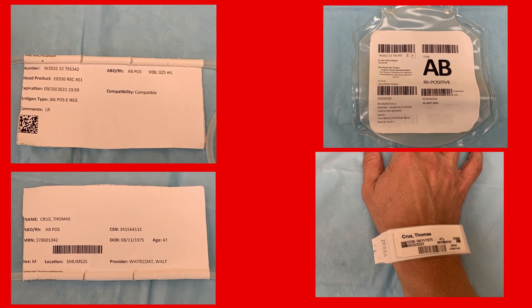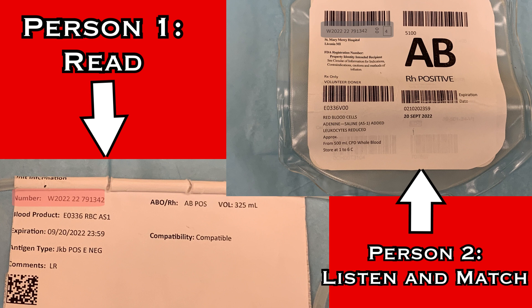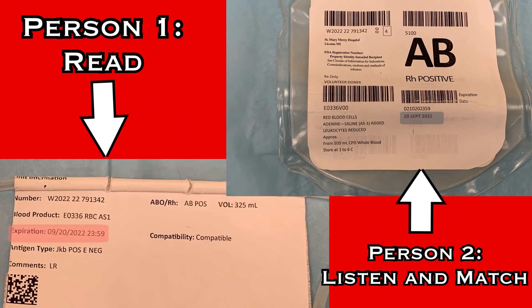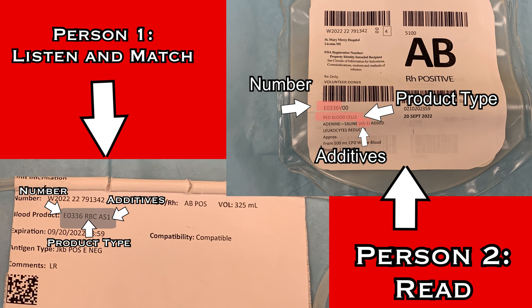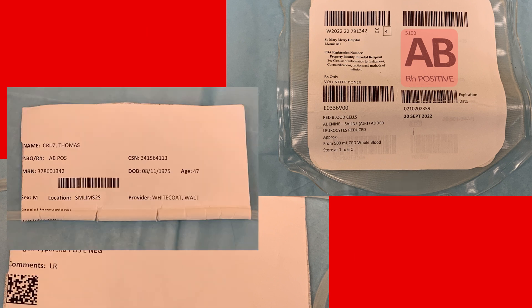If there are no discrepancies, move on to verify the product by matching information from the bag to the information on the other side of the sticker. Read the unit number: W202222791342. Read the blood product code: E0336RBCAS1. Read the expiration date: 9-20-22. And finally, the blood type: AB positive. Then check that the patient's blood type on the opposite side of the sticker matches to ensure they are compatible — the patient is also AB positive. Then reverse the process and have the information read back: unit number W202222791342, blood product code E0336RBCAS1, expiration date 9-20-22, blood type AB positive, patient also AB positive.